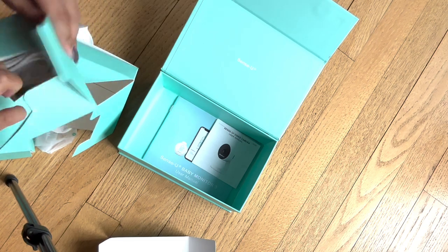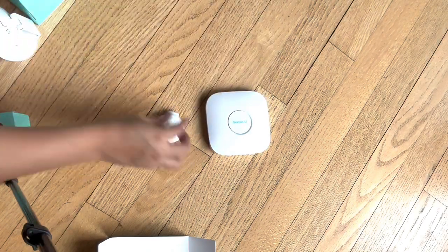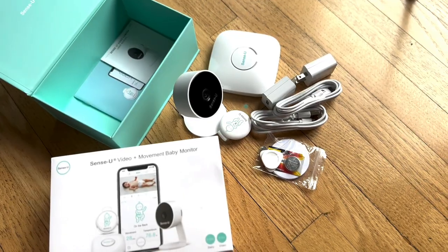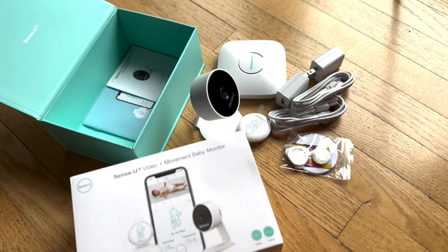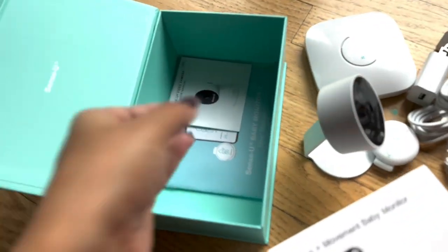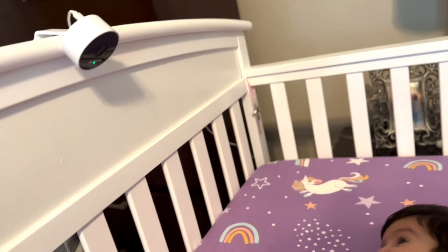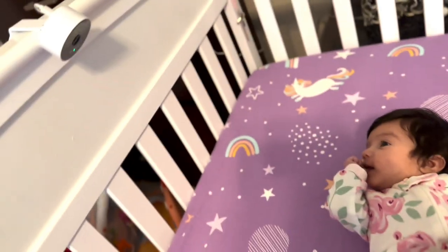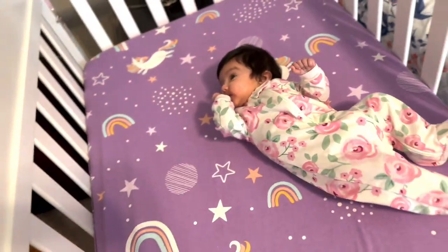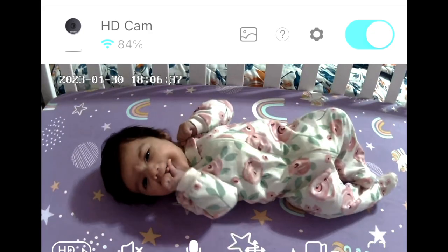It also comes with all the chargers and plugins required to operate these devices. Here is an overview of everything you get in this set — it also has extra batteries and plugs, you are all set. I love how easy this is to set up, not at all complicated. Here are all the instructions, and here I am done setting up — it took me barely a couple of minutes. Azara actually likes looking at it, and I like looking at Azara with the help of this HD camera.